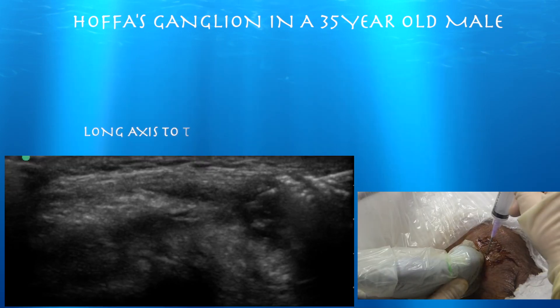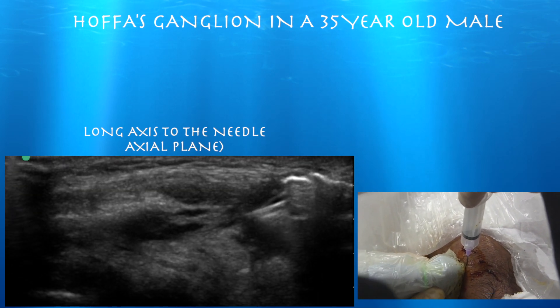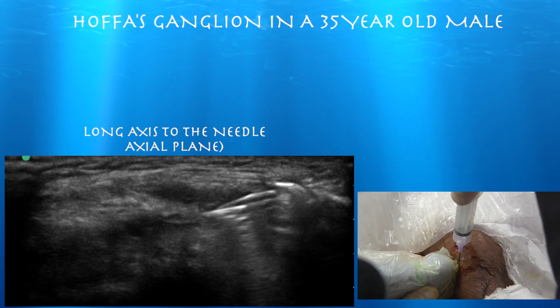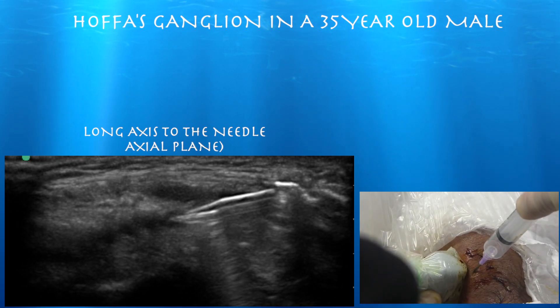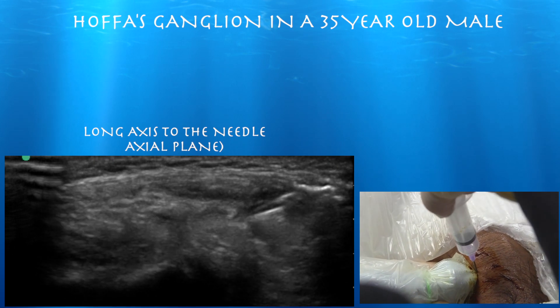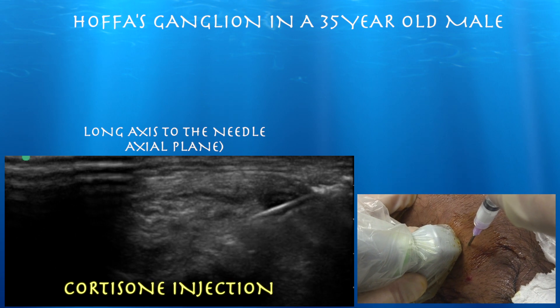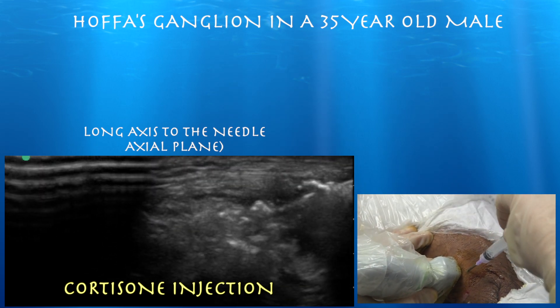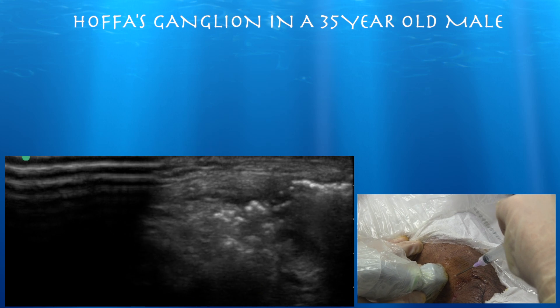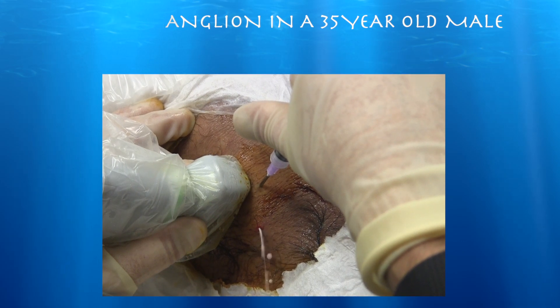Here we are going through a second site to try to get the more proximal portion of the ganglion. And here I'm basically threading the needle down this little stalk — something that you really can't do without any kind of image guidance. The cortisone then went out through the other hole. So this was an unanticipated finding: the track from the initial needle was so large that essentially most of the cortisone just went out right through it.